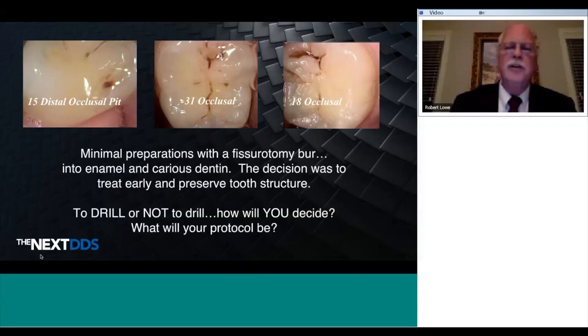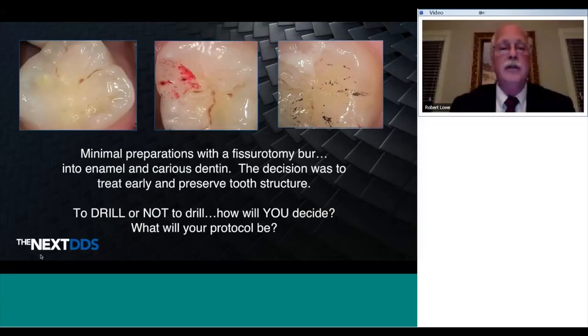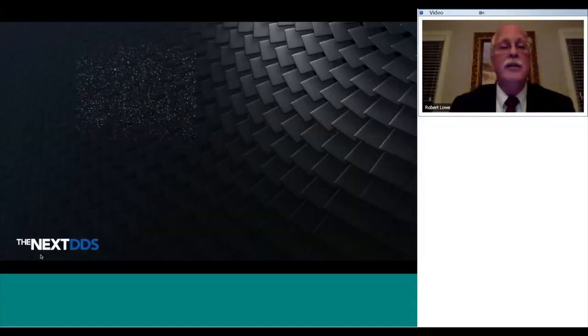Minimal preparations can now be done with fissurotomy burrs. We don't have to use a 699 or 557, the burr that we learned with in operative dentistry in 1978 at Loyola University School of Dentistry, cutting my first dog bone extension for prevention cavity preparation on tooth number 19 for a small little occlusal pit in the central sulcus, making a big preparation, cutting away 90% of healthy tooth to restore a small little caries pit. We don't have to do that anymore. The decision in my mind is to treat early, preserve tooth structure. We have restorative materials today that are bioactive materials that help replenish lost minerals. We'll talk about those, because these fissurotomy preparations can be small.